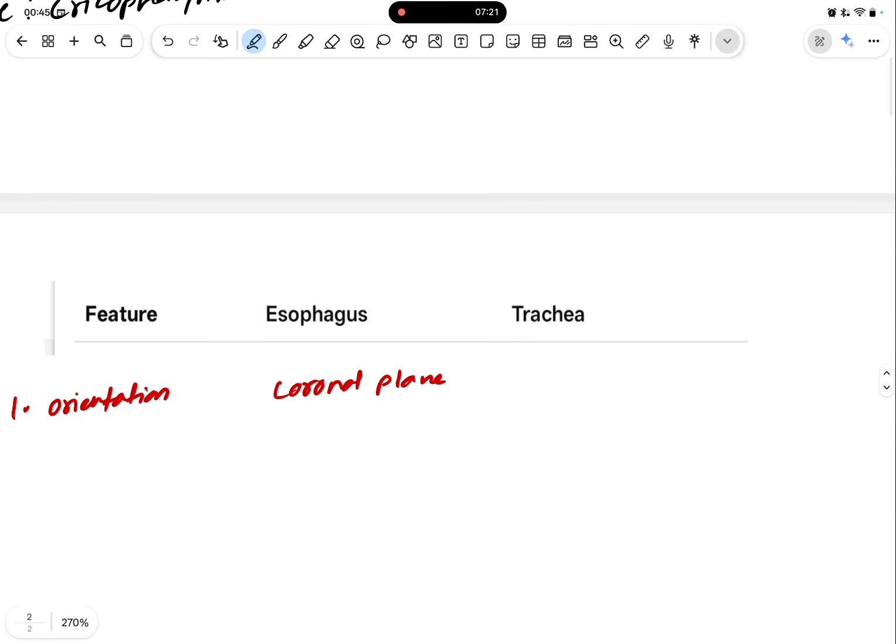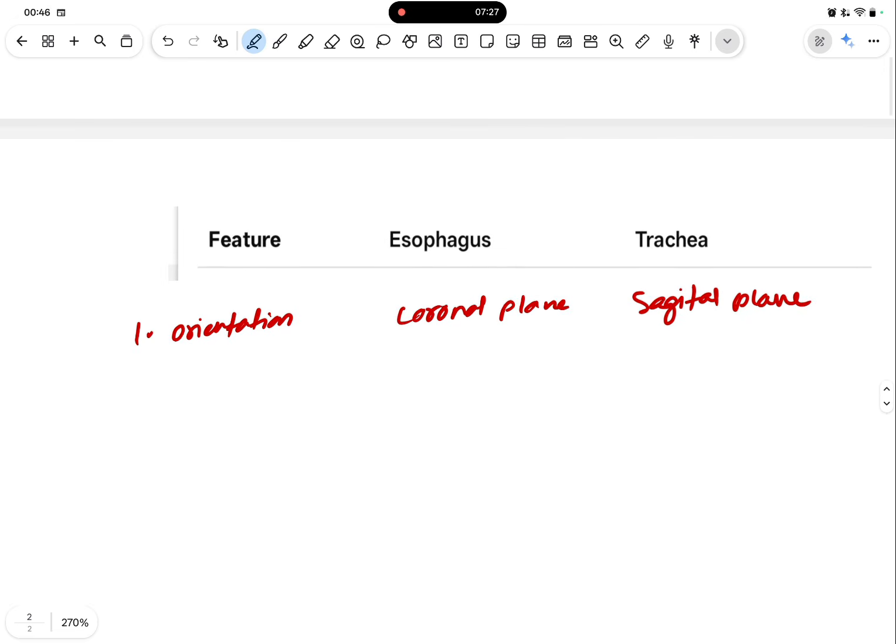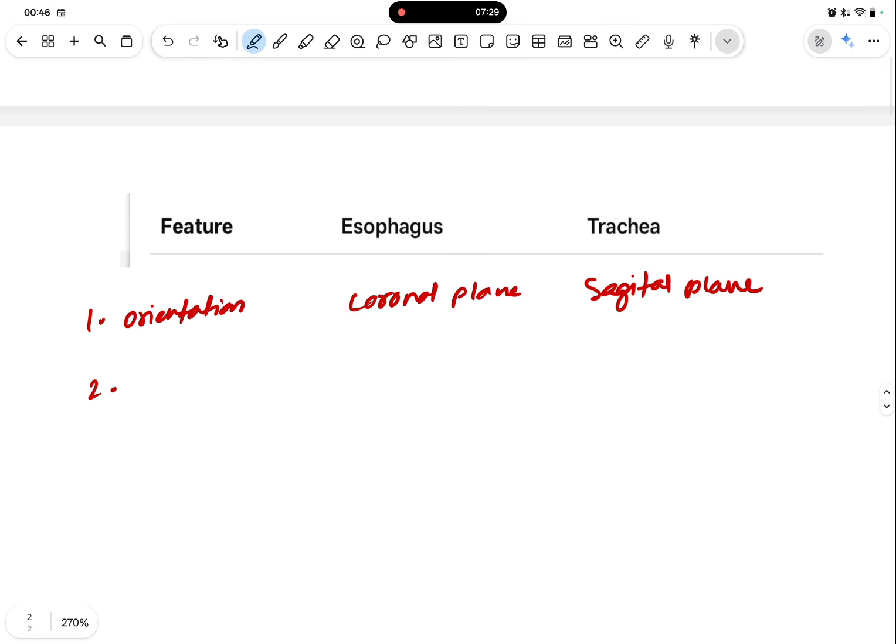In case of anterior posterior X-ray, in case of coin in the esophagus, we will see the face of the coin.